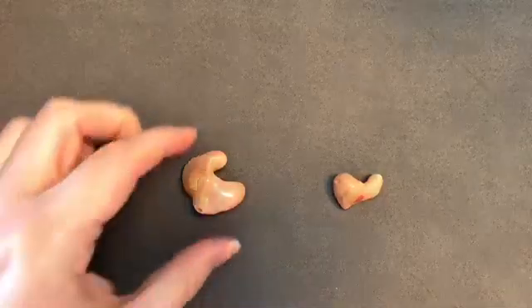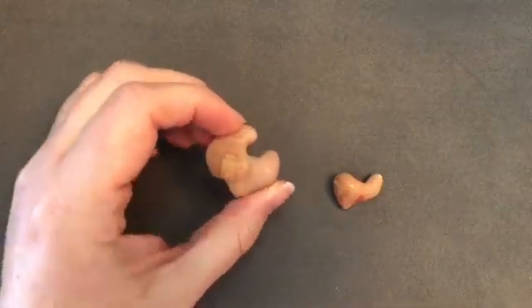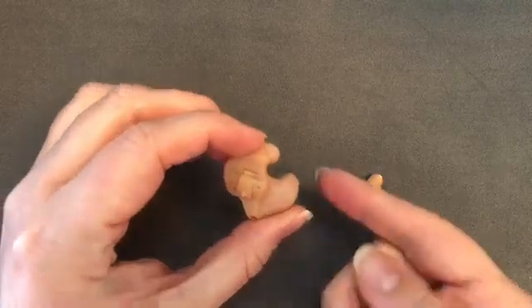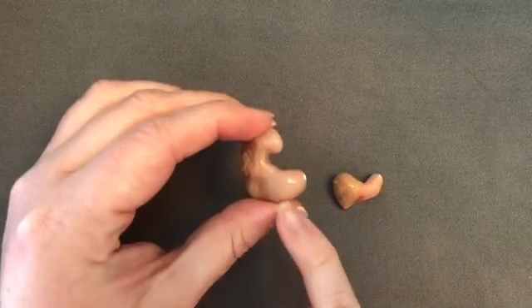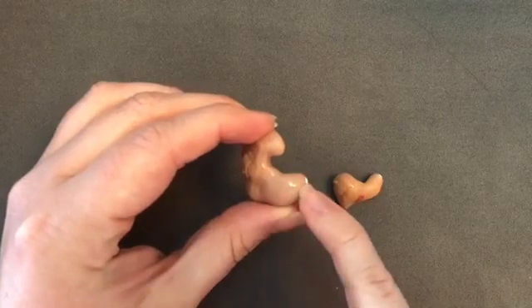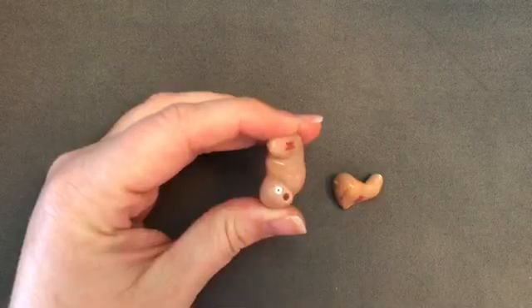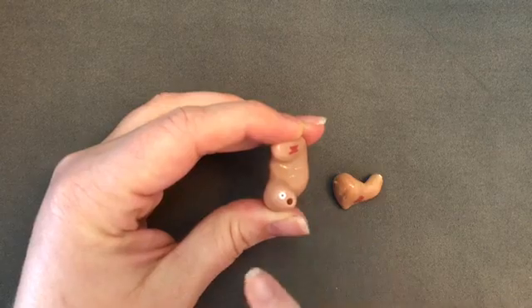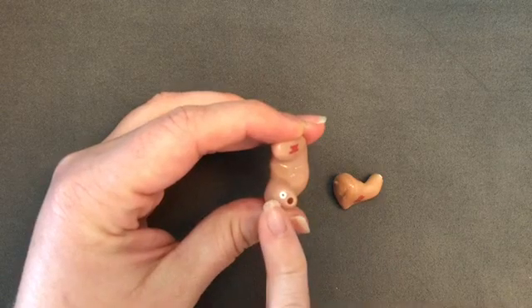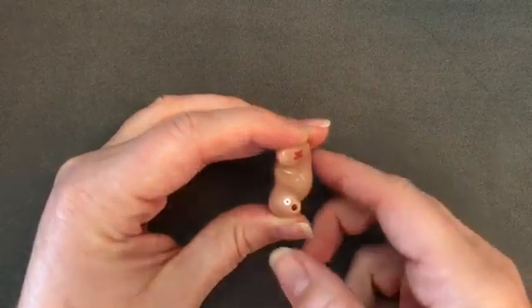We'll first take a look at the ITE and ITC since they're fairly similar. Here's the ITE on the left — that's the largest of the custom styles and fills up most of the ear and bowl of the ear. This is the canal portion that fits into the ear canal where an ear plug would, and we've got two openings at the end of that canal portion: the air vent here at the bottom, and at the top with the little white wax filter in it is the sound bore where the sound comes out of the hearing aid.